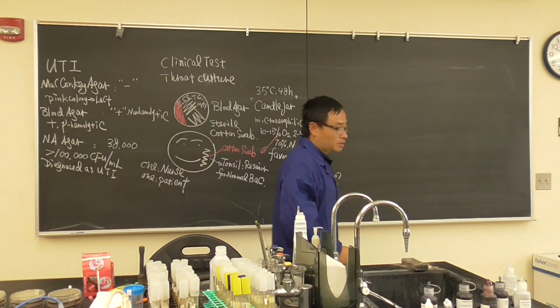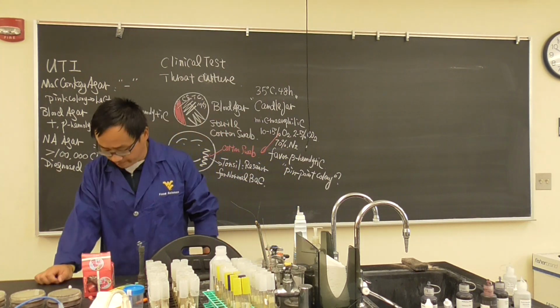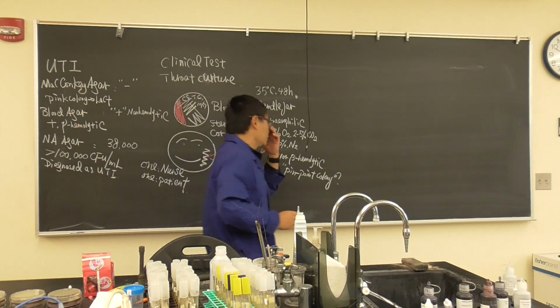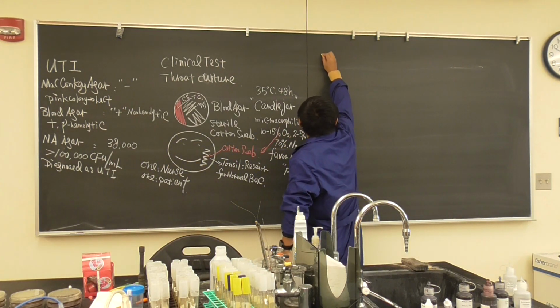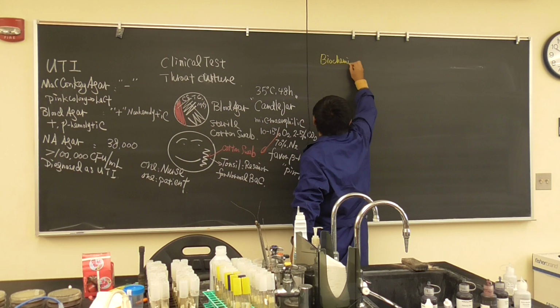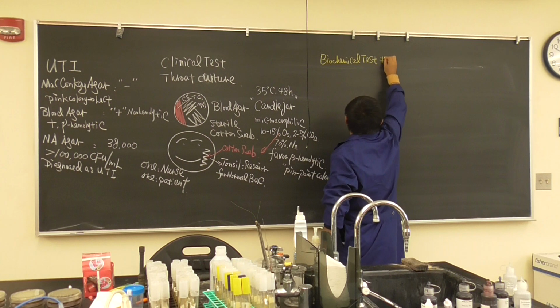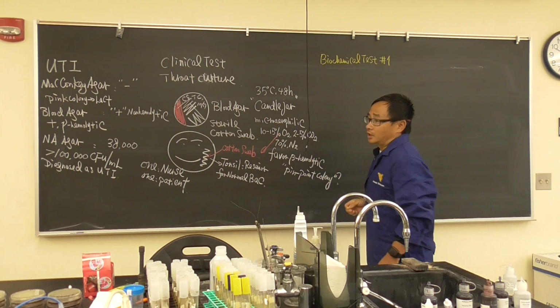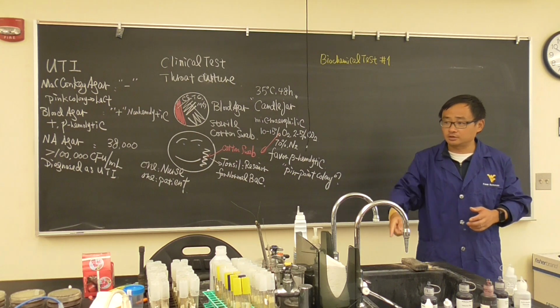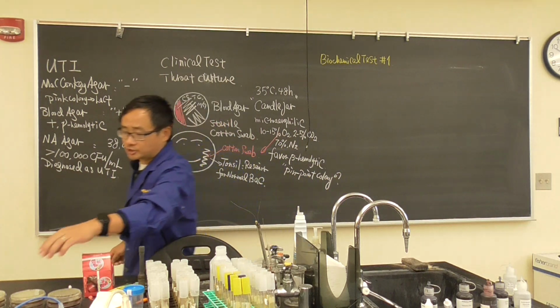Okay, some other work we're going to do today is the biochemistry test. This will be a big deal for the final exam, so we have to talk about it. This is biochemical test number 1. And usually we have another fact sheet you can take. Okay, yeah, I grabbed that. And the fact sheet is right here, on chapter 15.